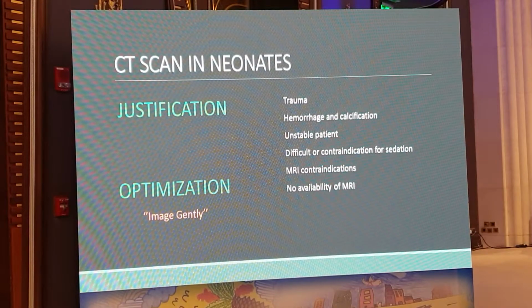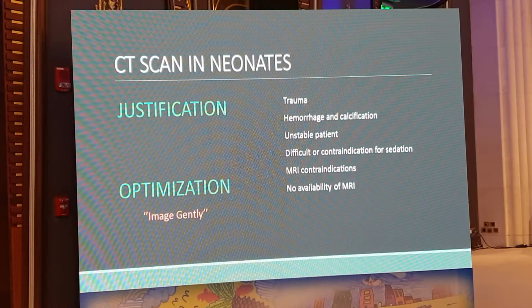Optimization means we have to tailor the CT scan to fit the patient's age and size, and that's what we are doing with all pediatric age groups.